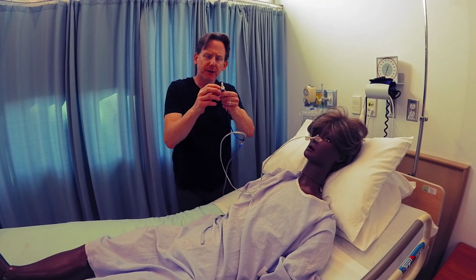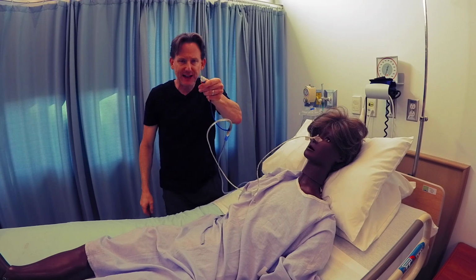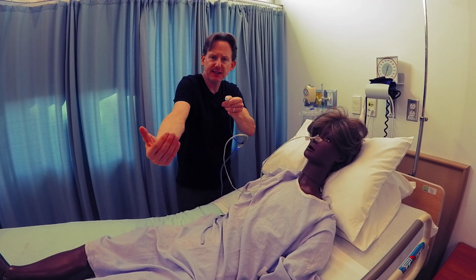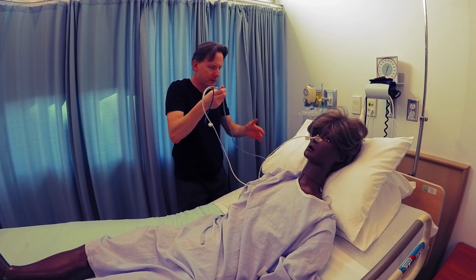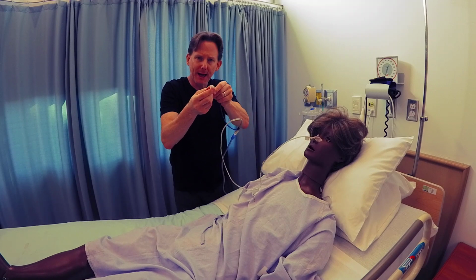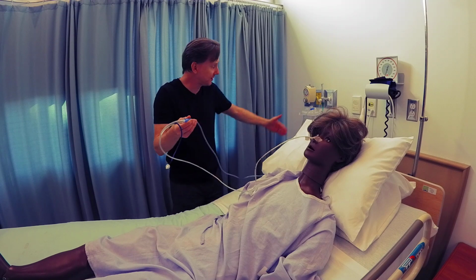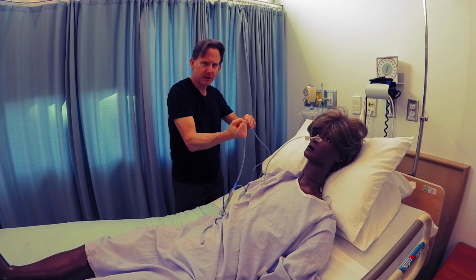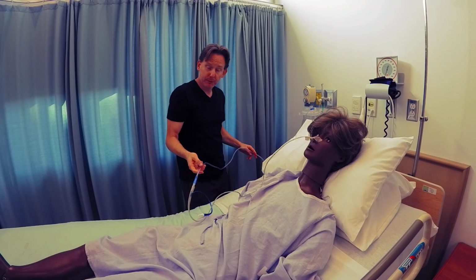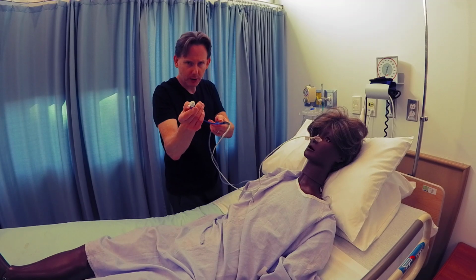Then you're looking at this filter here. This is an air filter, and notice how the holes are facing outwards. That's how it should look, because it needs to suck a small amount of air into the system to maintain movement in the tube. If you find this is put on the wrong way and there's no holes showing, what you're going to find is there's no net movement in the whole suction system, because a vacuum is being created, because with no air, this is a closed vacuum. So if you come across a situation where there's nothing flowing in the tube, it could be because this filter is being put on wrong.